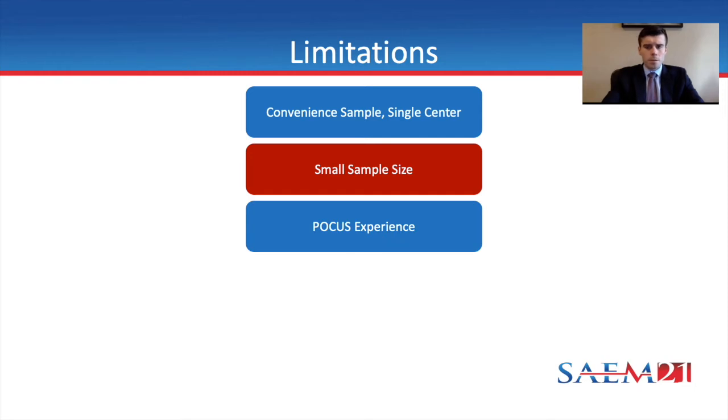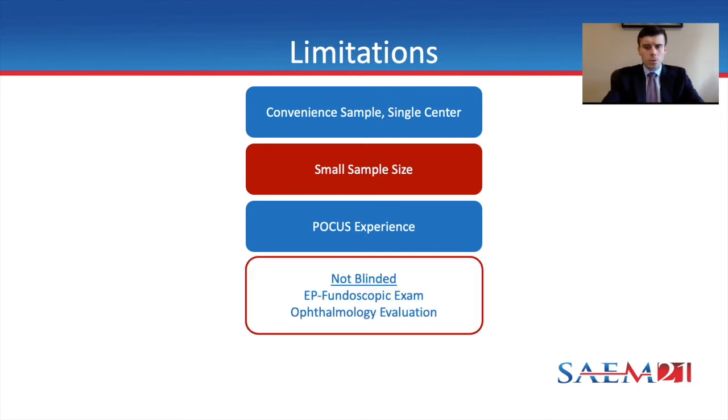Our program also has a very robust ultrasound division that does ocular ultrasound routinely. Not all emergency departments have similar access to the tools and training, and this may limit applicability to all emergency departments. And lastly, although our ultrasound exam was blinded, the emergency physician fundoscopic exam and the ophthalmology evaluation were not blinded to the patient's chief complaint.